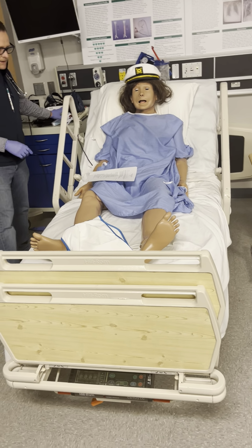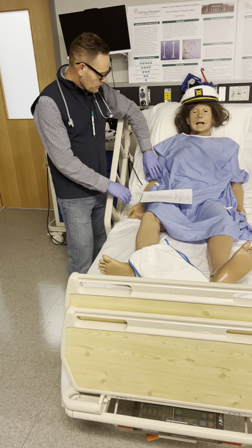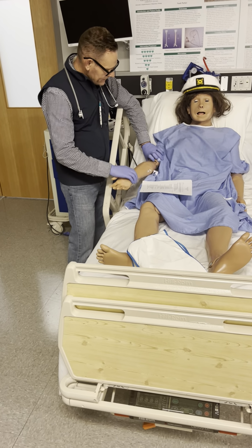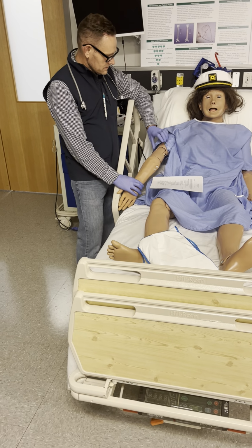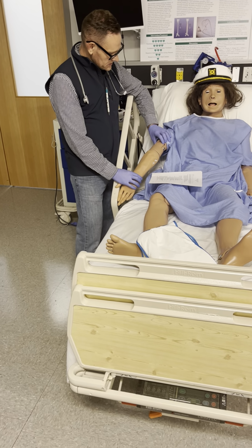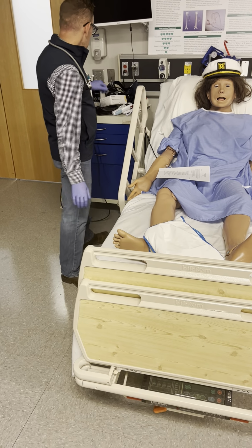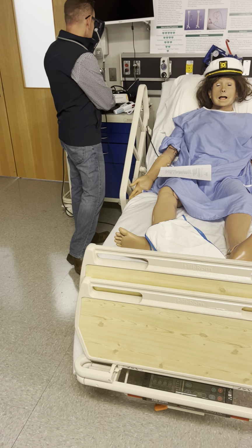All right, so now we're gonna get a blood pressure. I'm gonna palpate for her brachial artery. I'm gonna hyperextend that arm a little bit so I can palpate a little bit easier. It's a little bit medial of center, so it's a little bit towards her. Once I palpate it, I'm gonna take my cuff.